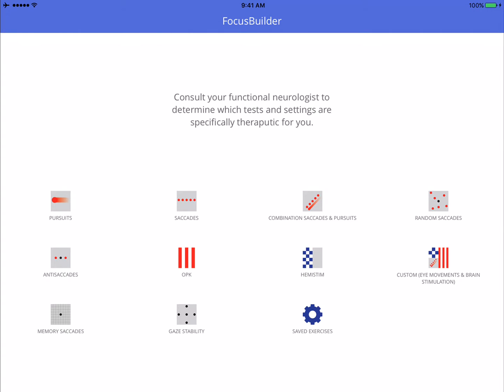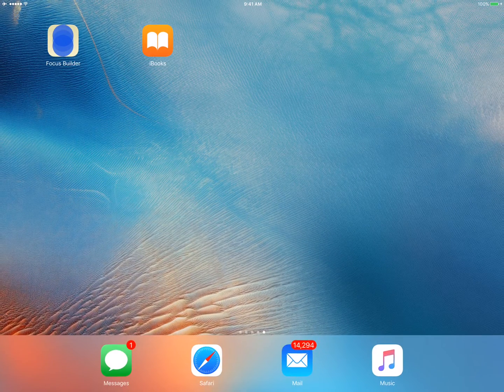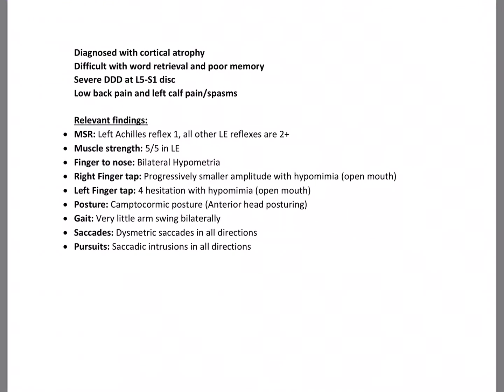Okay, I'd like to show you how I use the custom exercise in the FocusBuilder app with a patient that I actually saw today. Before we get into that, I just want to give you a little overview here of some of the findings.